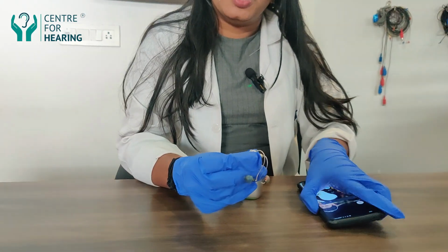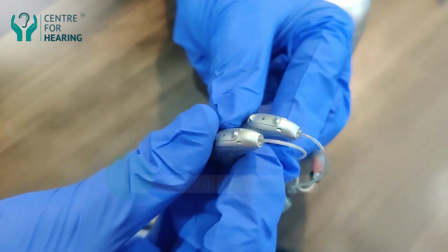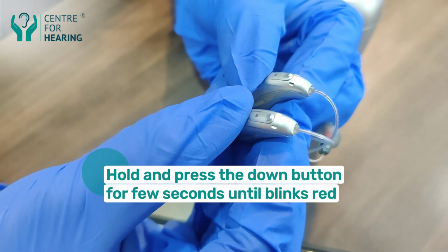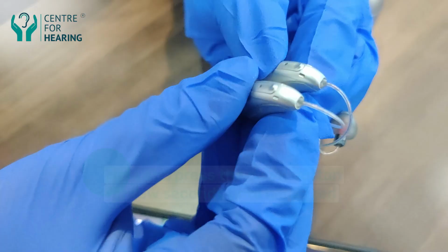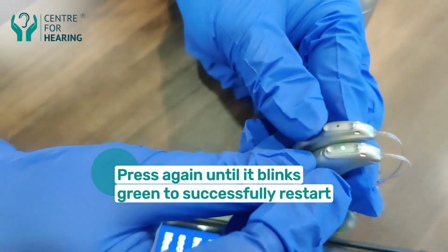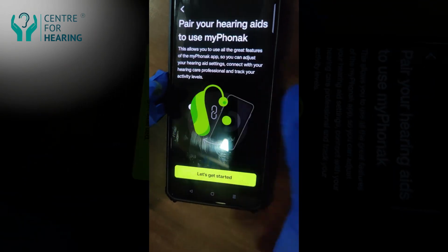So for that, first you need to restart your hearing aid. On top of the hearing aid, there is a button. Hold and press the down button for a few seconds. It will blink red. Again, if you press, it will turn green. We have restarted the device. Now pair.